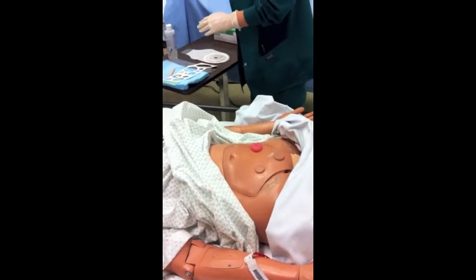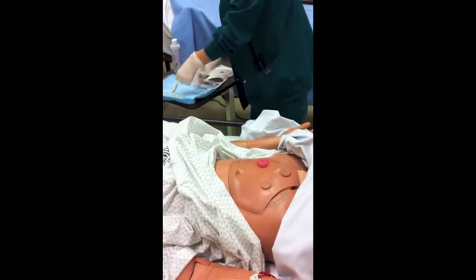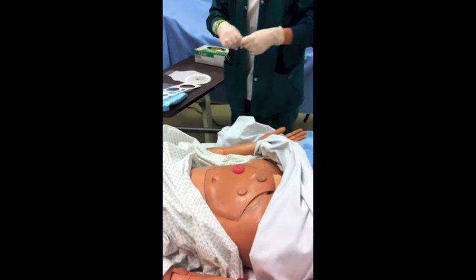This is going in a linen basket. Next, I'm going to be applying skin prep to the area around the stoma.